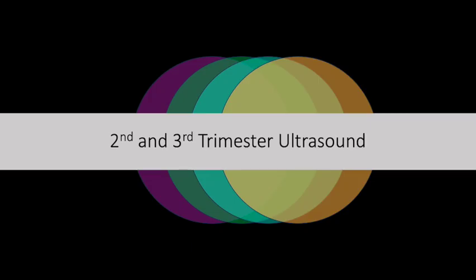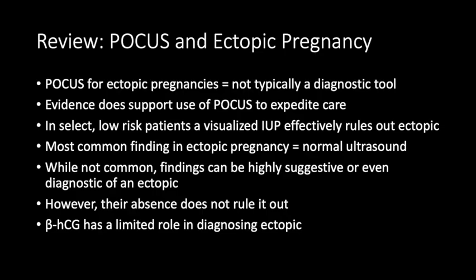Welcome to the third lesson in our lectures on POCUS for women's health. This lecture is going to be focusing on second and third trimester ultrasounds during pregnancy.